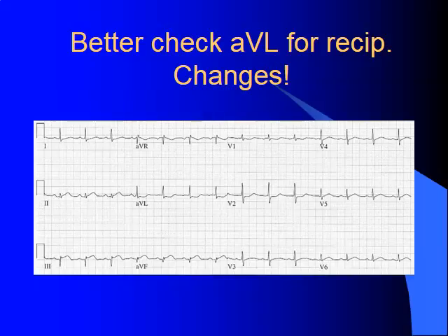But this is just what I was talking about. As we delve into this determination of axis, make sure that you remember why it's important. It's easy to assign a number to an EKG and say what the axis is, but really understand what we're talking about, and that's going to help you pick up subtle things like this.